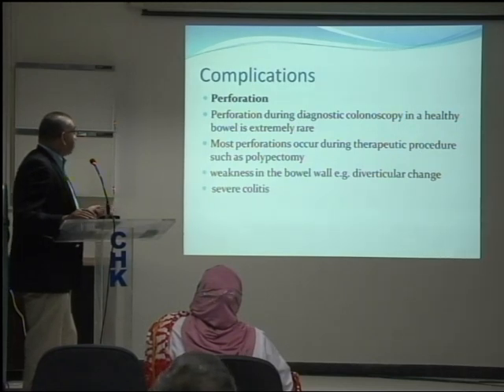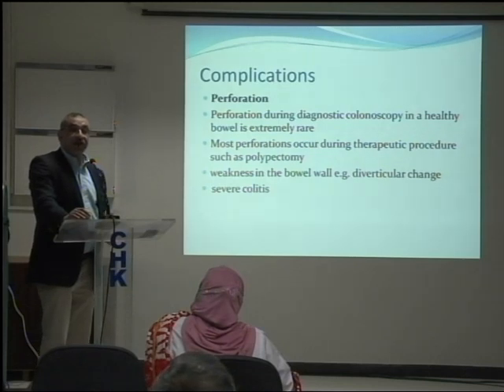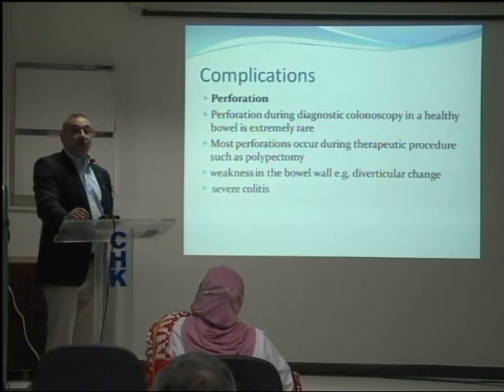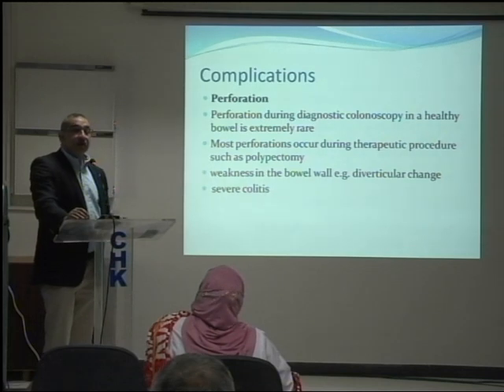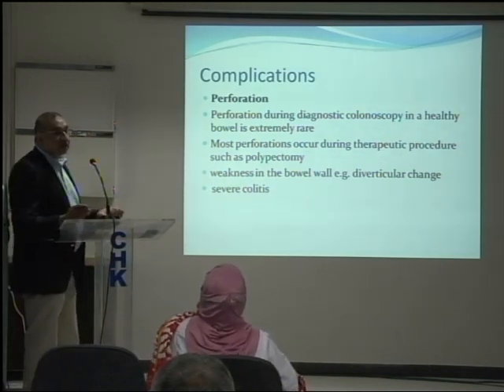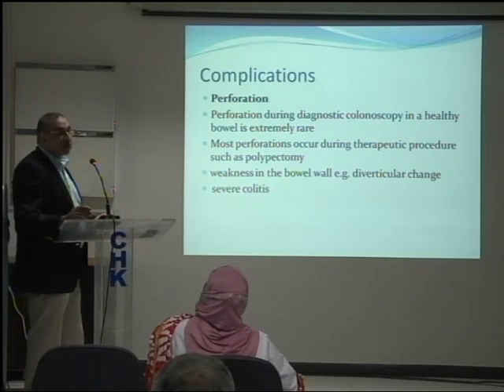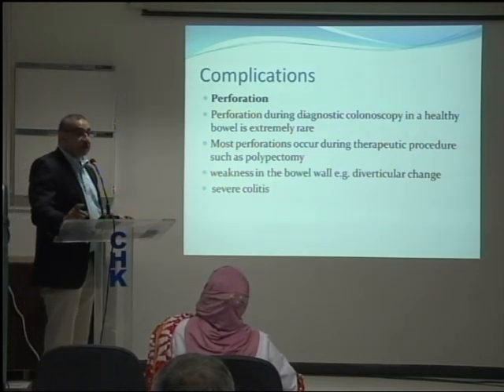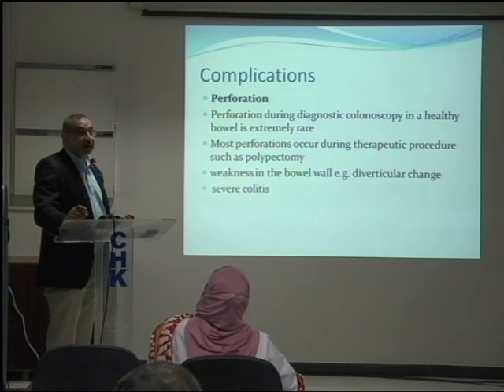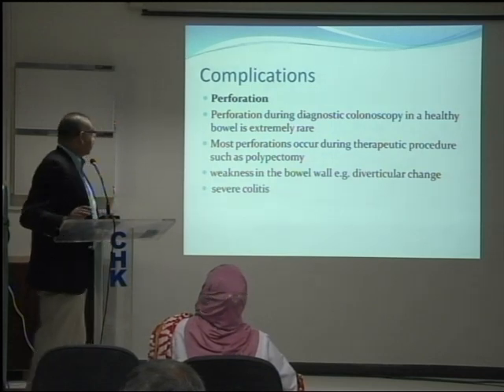Yes, it is acceptable, because if you carry out polypectomy or any therapeutic procedure like dilatation of the colon, treating a bleeder, or doing APC, then it is a well-recognized complication. Or if there is extensive diverticular disease, then it is possible. But as I said, if you find it difficult, if there's extensive diverticular disease, then do not proceed. Get somebody more experienced to do the procedure for you.